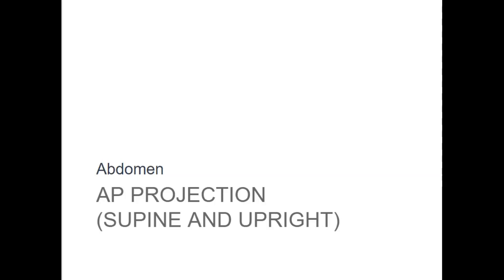Welcome to part 3 of our image analysis guidelines on chest and abdomen. As we move forward, we will take a look and review abdomen projections.